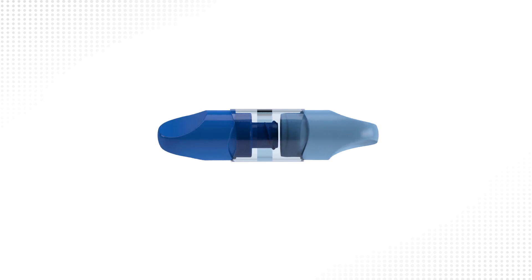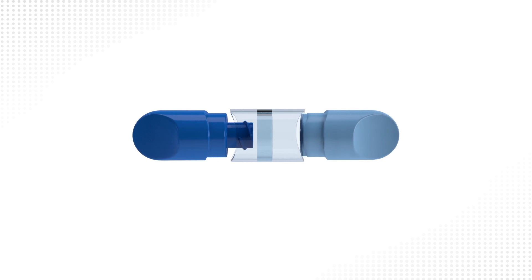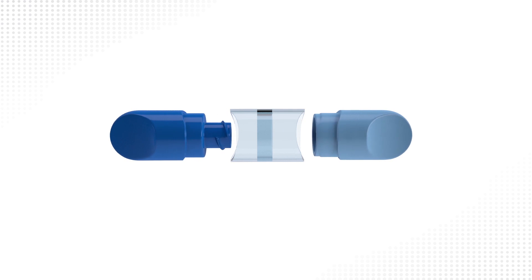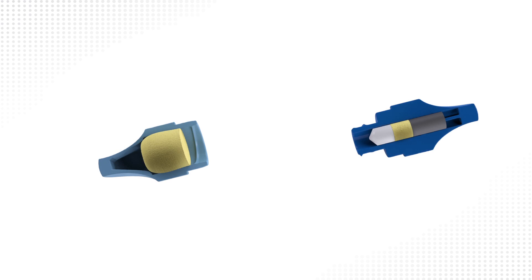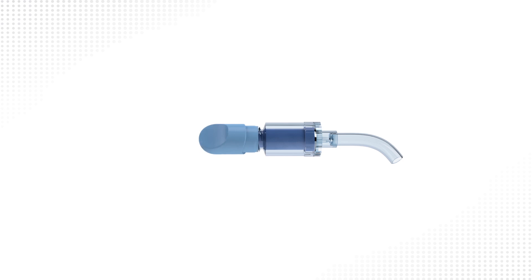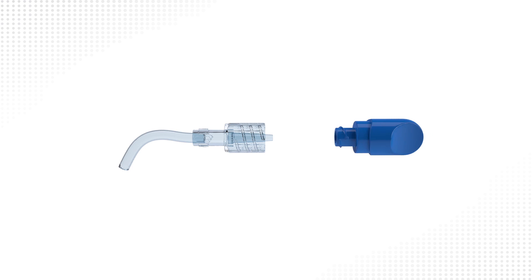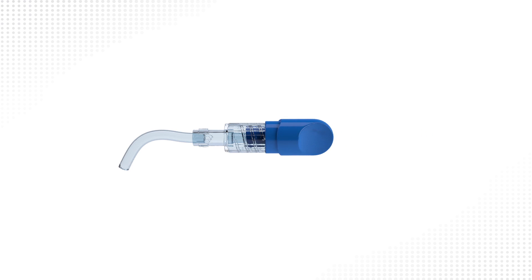The dual cap system consists of two caps. Each cap contains a sponge saturated with 70% IPA that disinfects all critical surfaces of IV access points. The light blue cap is designed for use on needle-free valves. The dark blue cap is designed for use on male luer connectors.